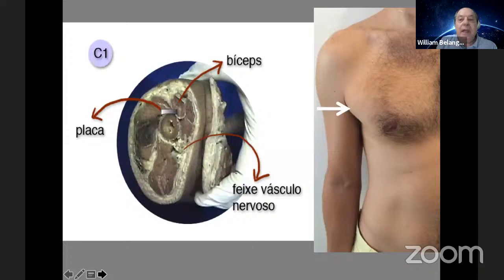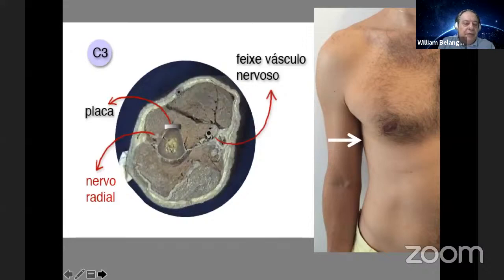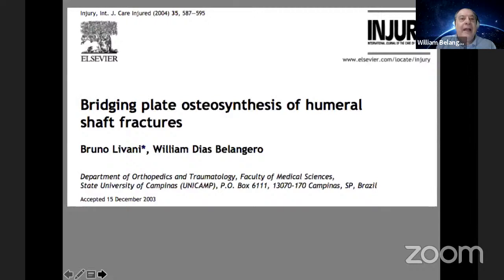The thesis was written in 2001. These are some images of the topographic anatomy of this region. You can see the relationship between the plate and the vascular nervous bundle, and the plate and the anterior aspect of the arm and the radial nerve. As you go down, you see the radial nerve is far away from the plate. You see it here in another slice. This was the thesis from Bruno Livani, my colleague, my friend. And this is the paper that we published in 2004, describing the technique and presenting these 15 patients.